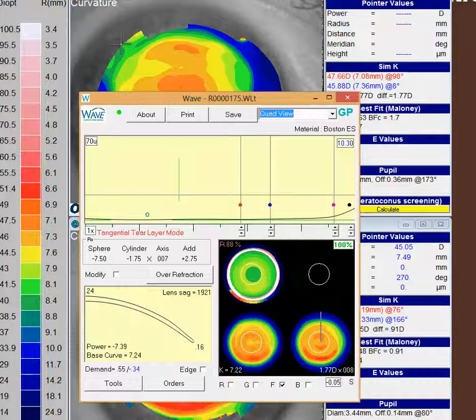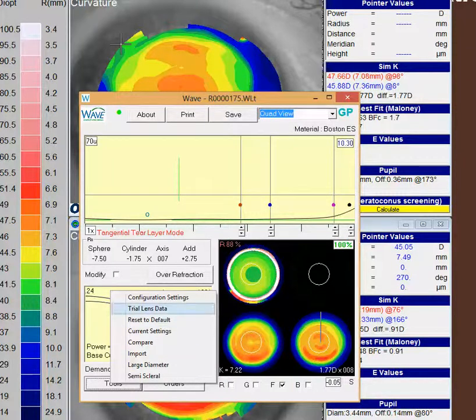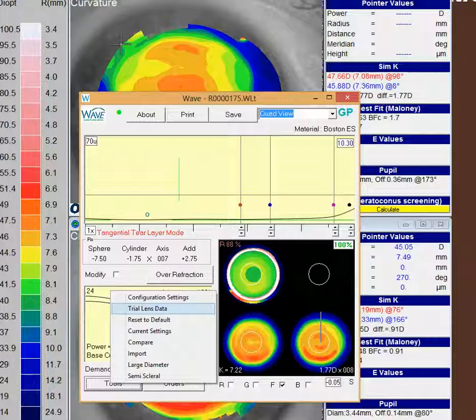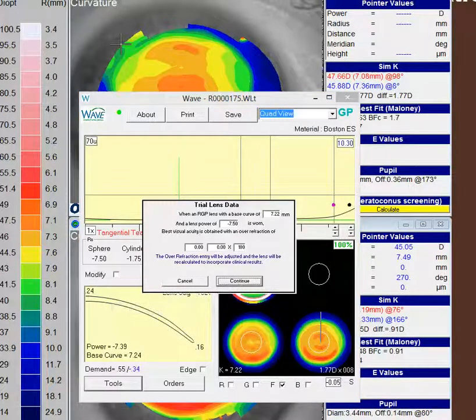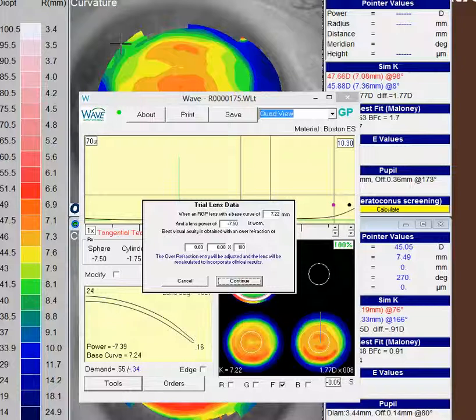I mentioned the trial lens tool in case you haven't seen that yet or used it. Quite often I like to take a lens of known spherical quantity when I'm getting my initial measurements. I'll take a base curve, I'll put a base curve with a sphere on there and just get an over-refraction over that because that way you've got nice and clean data.